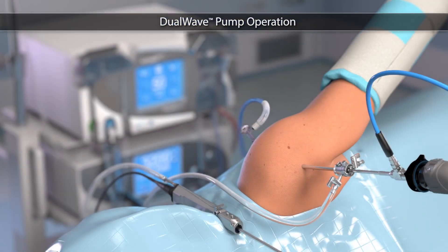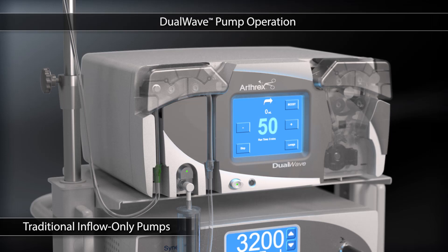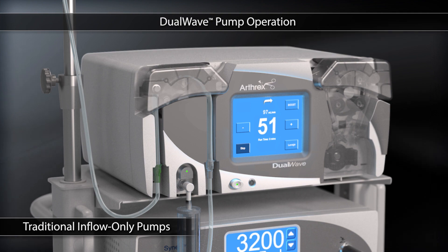In arthroscopic surgery, a pump is often used to assist the surgeon in distending the joint space for better visualization. To properly manage interarticular pressure, the flow of saline must be tightly controlled. Traditional pumps function as inflow-only pumps, and the surgeon must carefully maintain joint pressure by manually controlling outflow to avoid complications during surgery.